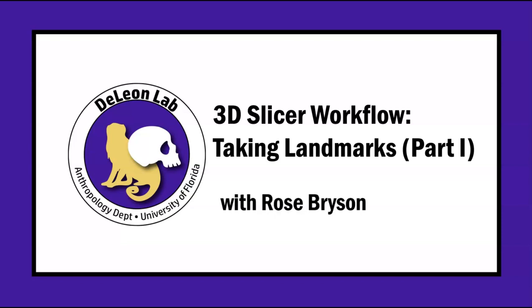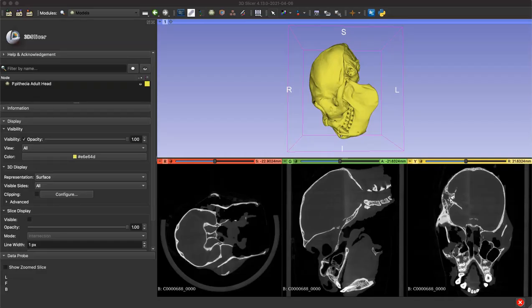Hello, my name is Rose Bryson and welcome to this tutorial on taking landmarks for morphometric research in the 3D slicer application. Today we'll be covering how to take single landmarks, but future videos will explain how to capture open and closed semi-landmark curves.